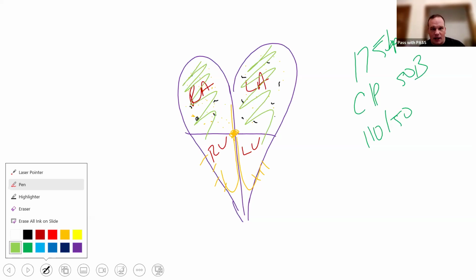Can we just get him to the hospital? Is it worth a call to medical control? That's what I would tell you to do. MD means makes decisions, right? Call them and get their perspective of, hey, I got a 72-year-old female. She is in AFib with RVR at a rate of 175. She's complaining of some chest pain and difficulty breathing. We don't carry Cardizem, so I can't do it pharmacologically. Would you like me to synchronize cardiovert this patient?